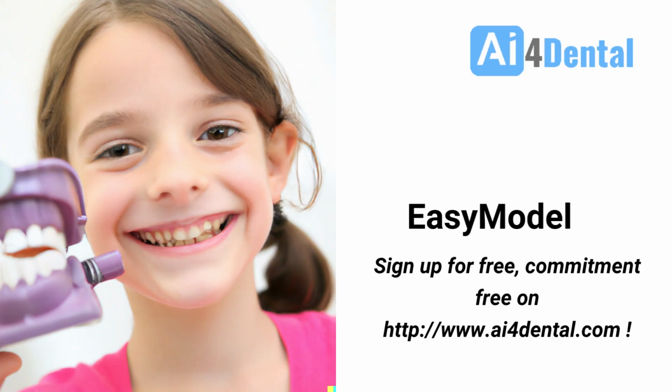So free yourself from tedious tasks and concentrate on the essentials of your profession as a prosthetist.